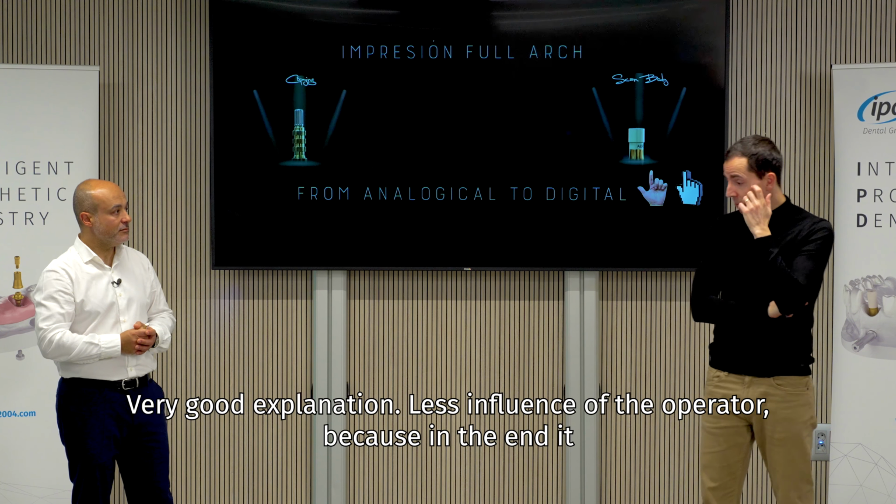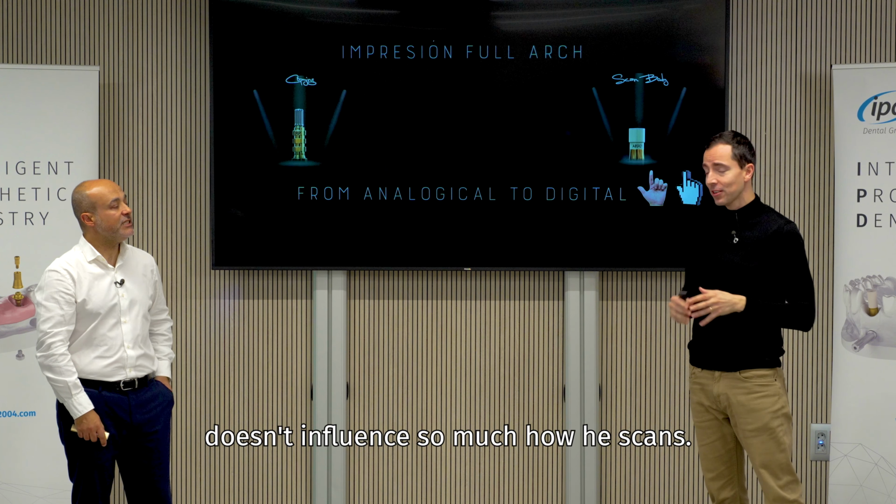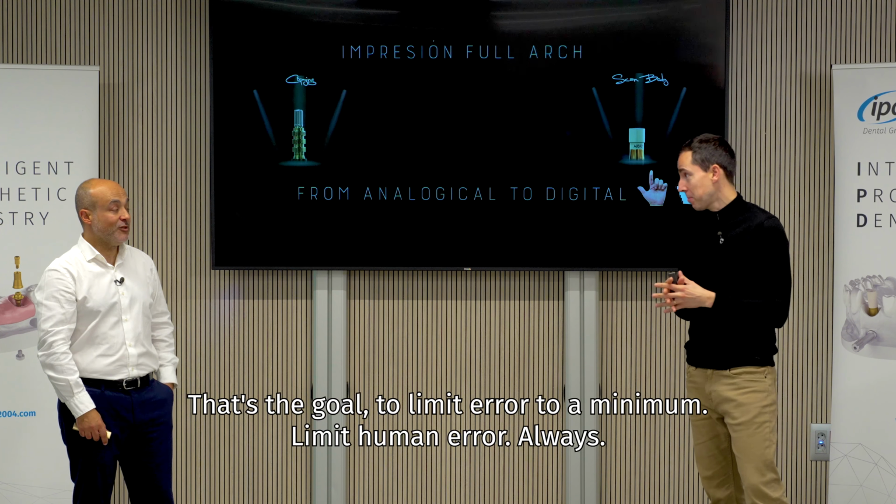Very good explanation. Less influence of the operator, because in the end it doesn't influence so much how he scans. That's the goal, to limit error to a minimum. Limit human error, always.